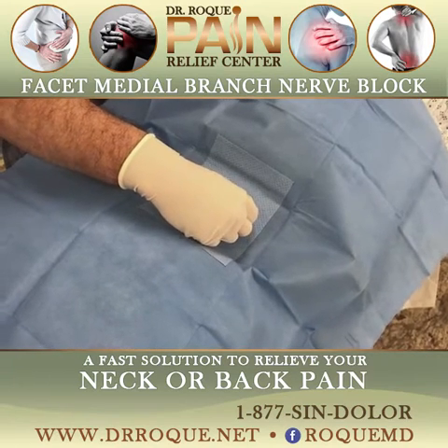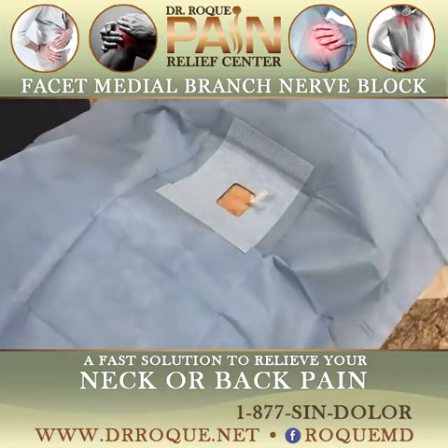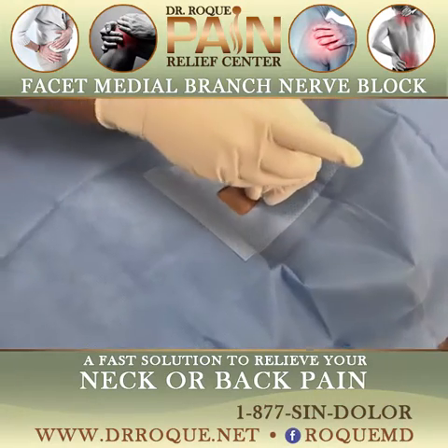Here we go. Now you're going to feel it right here. Is that the pain? Yeah. It is? Good. I'm going to put the medicine and we should be done in a second.